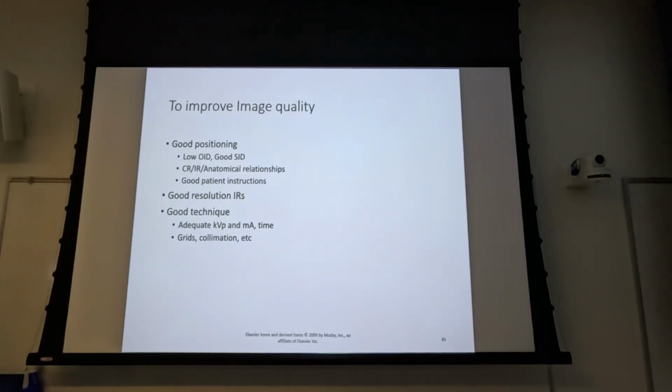So if you're at 40 inches, your collimators may not open wide enough that you can get the entire tib-fib if you put the tib-fib on the image receptor from corner to corner, right? So how do you get a larger field size if your collimators are open all the way? Raise the tube, right, exactly. So 48 inches in some circumstances is a good idea, but generally 40 and 72 inches.